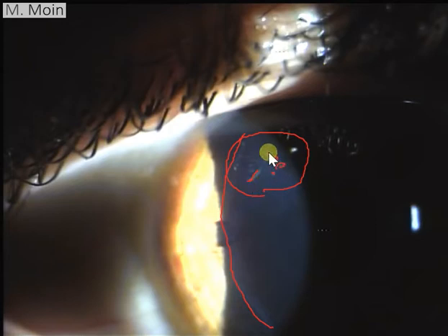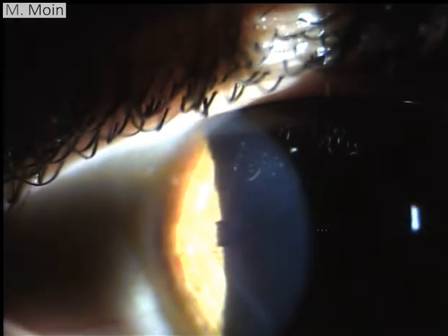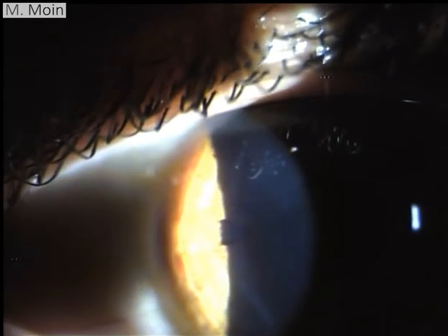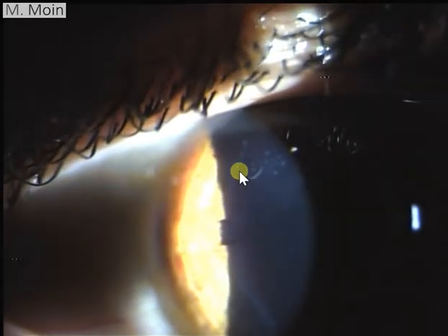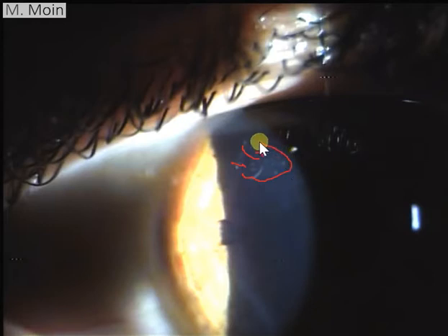This is an important and interesting finding - this is actually an area where the epithelium ingrows from the flap. When the flap is being made, what happens is the epithelium goes inside from this area and proliferates in this area.